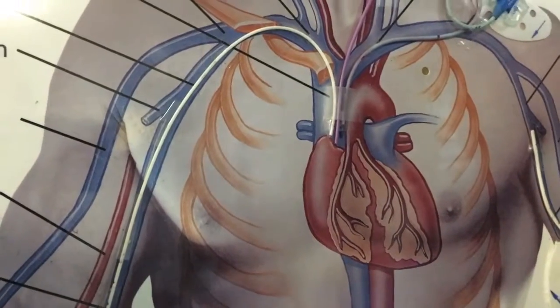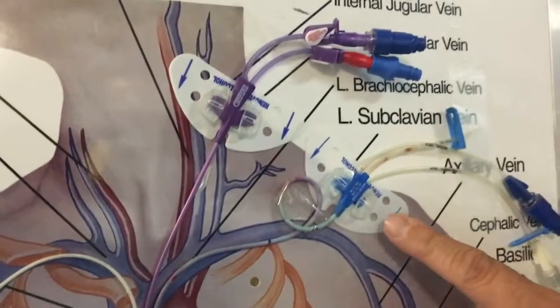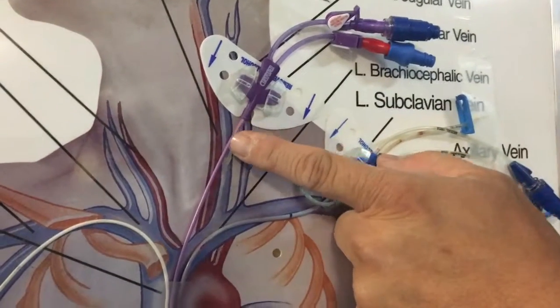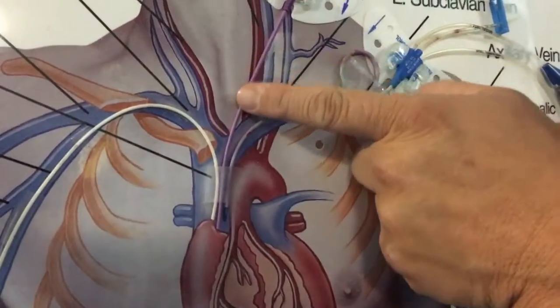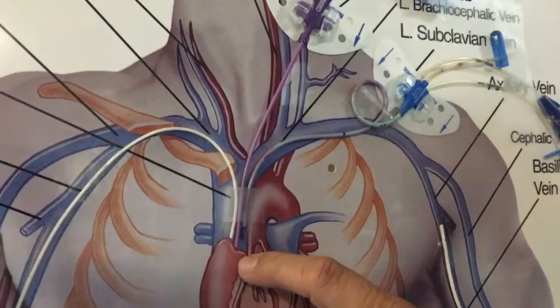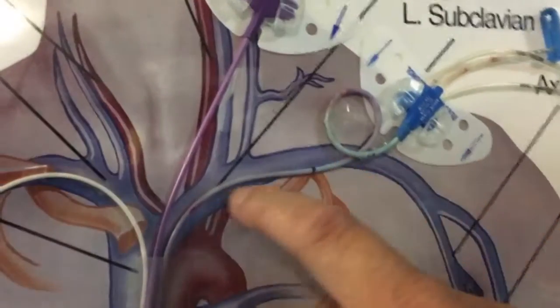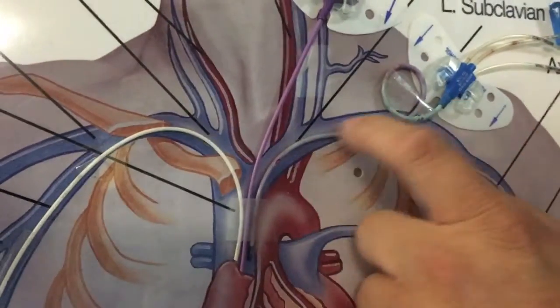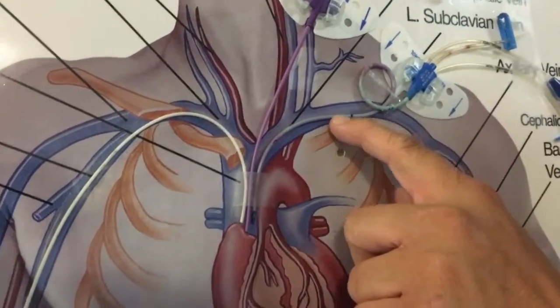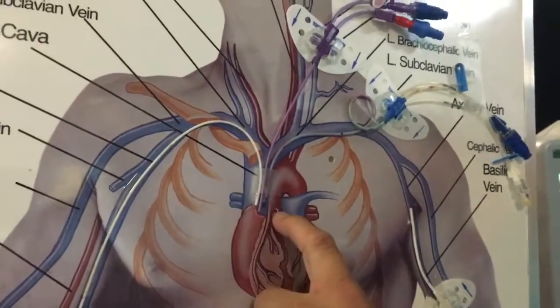Now, the other types of vascular access that you see in the floors are the regular central lines, which is either placed in the jugular vein, which is by the neck, and the tip, same as your PICC line, goes down and ends up on the distal end of the superior vena cava to the cava atrial junction. And the other way that the central line is placed is through the subclavian vein, which is this vein. In this particular example, it's placed on the left side of the subclavian vein, but the catheter goes down all the way to the distal end of the superior vena cava and the cava atrial junction.